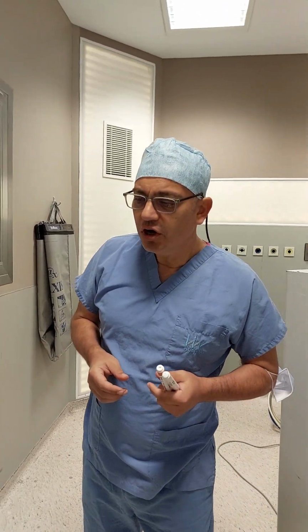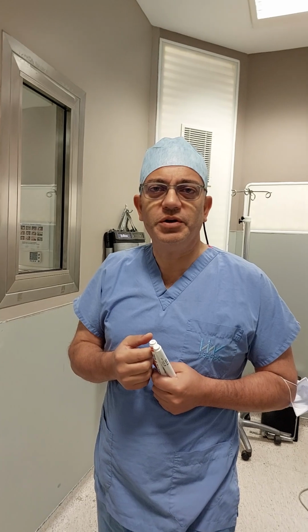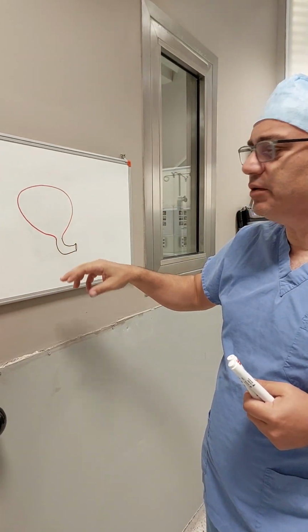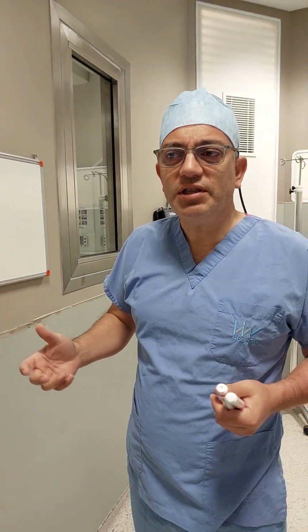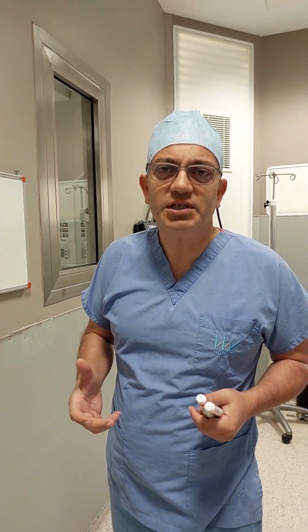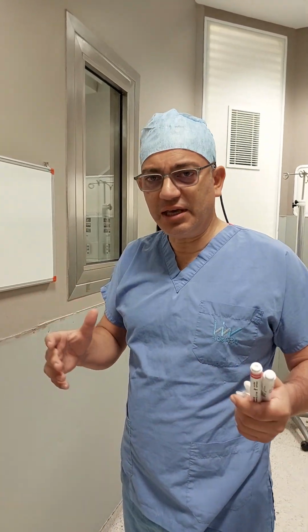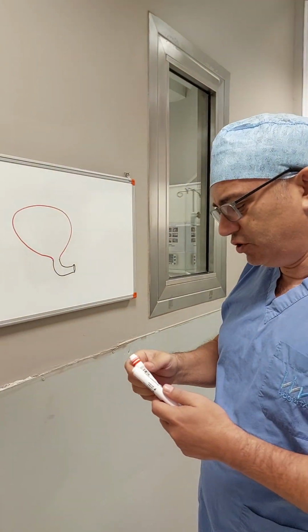Next day, we took her to the operating room, but this tissue was not visible. So we took the flexible cystoscope into the operating room, and when we looked with the flexible, we saw it. But with normal rigid instruments, it is invisible. So I noticed something, and I made a theory. Let me show it to you.